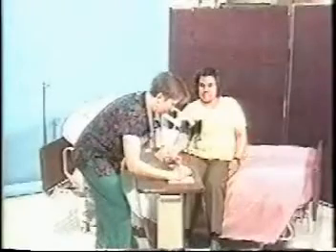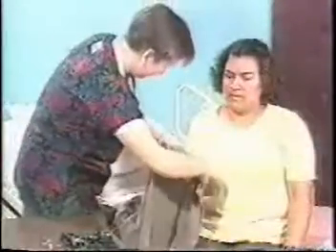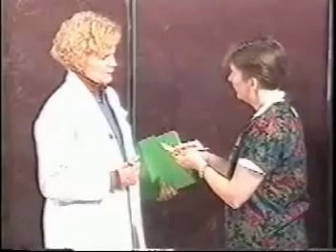If you're uncertain of your reading, repeat the inflation of the cuff after 1 to 2 minutes. Record the reading on paper. Report the deviations to the nurse.